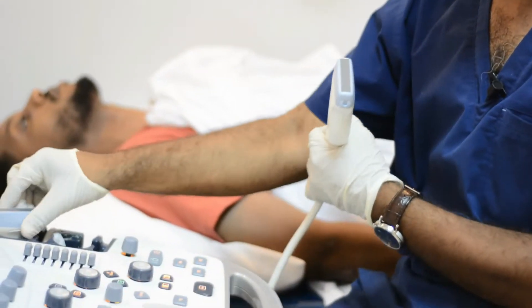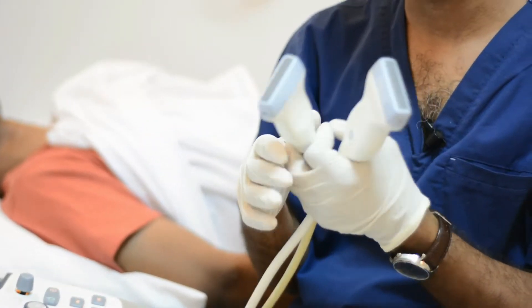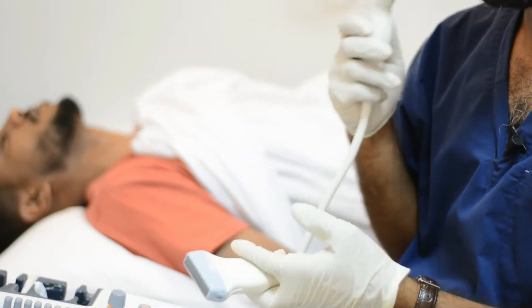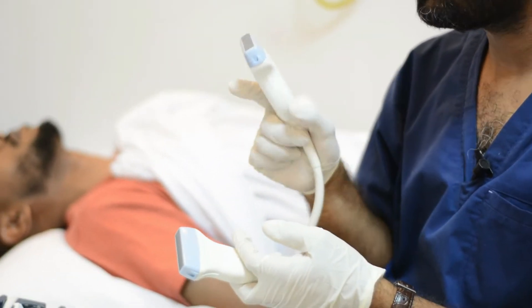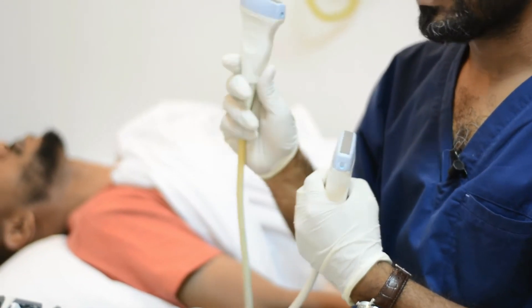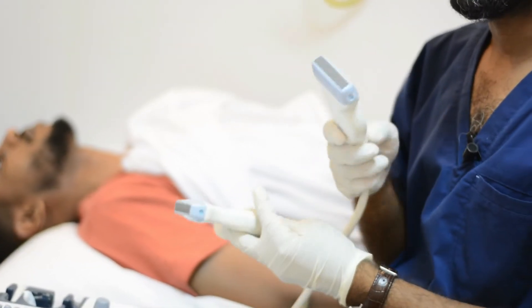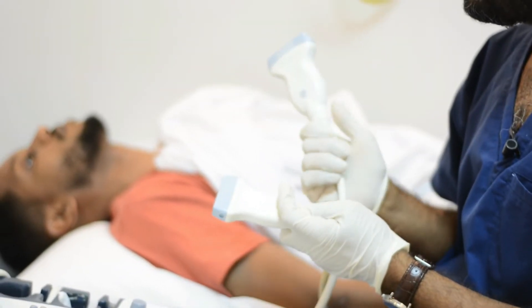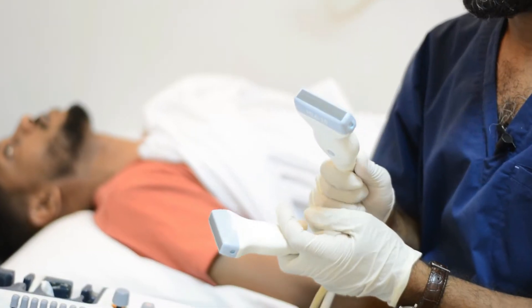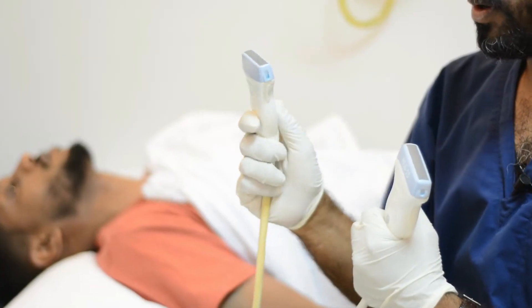First of all, I'm going to choose the best probe I can use. Here I have two linear probes: one with 15 megahertz, which will give me high resolution, and the other one with 9 megahertz. I'm going to start with the 15 megahertz probe. If I have a muscular patient or a patient with a short neck, then I will move to the other one.